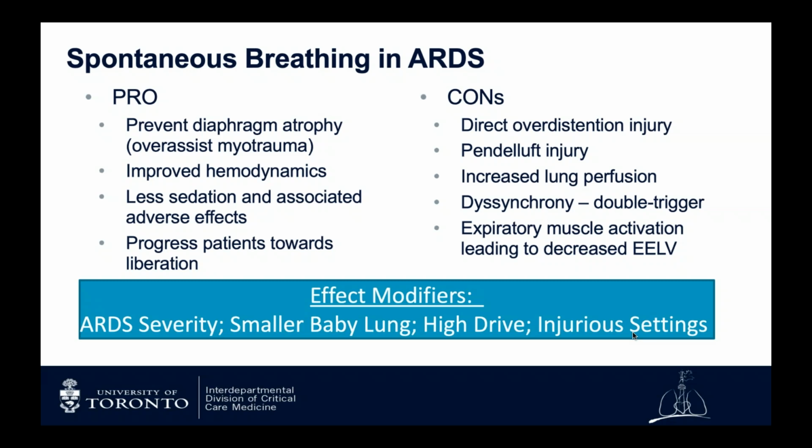The downsides potentially, though, are direct overdistension injury from patients taking bigger breaths than you want, this pendeluft injury that I just mentioned. We also may see increased lung perfusion, which may cause more interstitial edema and lung injury. When you start letting patients breathe spontaneously, then you have to worry about ventilator dyssynchrony, particularly double triggering, which can also cause injury.